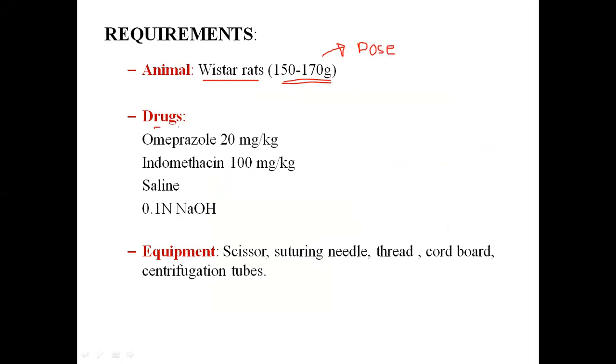Now see, in case of drugs, omeprazole and indomethacin. Omeprazole is a standard, well-established drug to treat the ulcer. Basically, it's an antacid. Then indomethacin is an ulcer inducer. Then we are using saline solution and 0.1 normal NaOH.